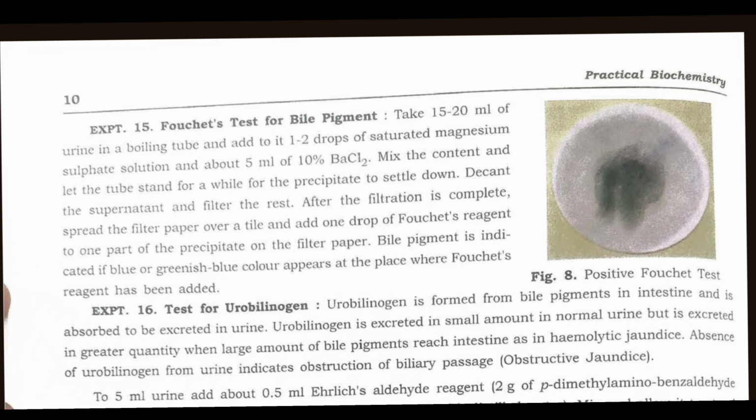Mix the contents and let the tube stand for a while for the precipitate to settle down. Decant the supernatant and filter the rest.